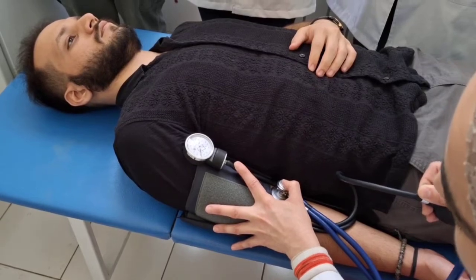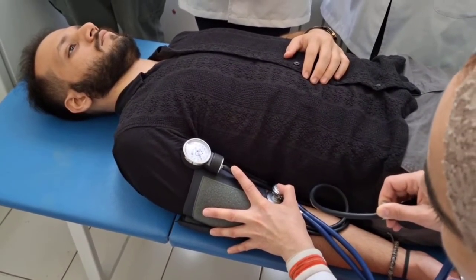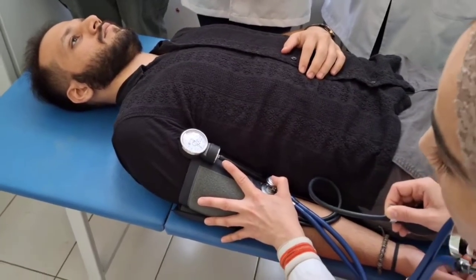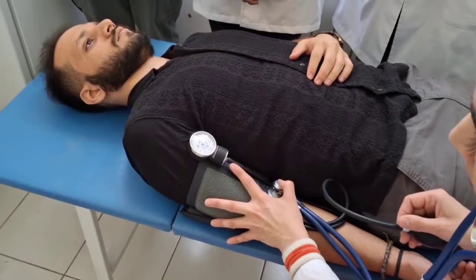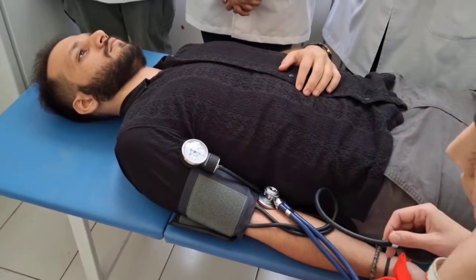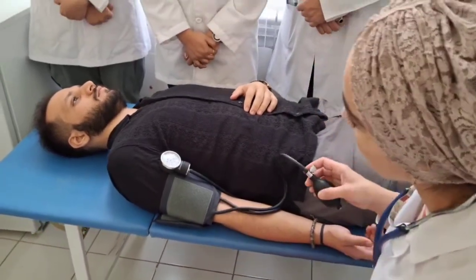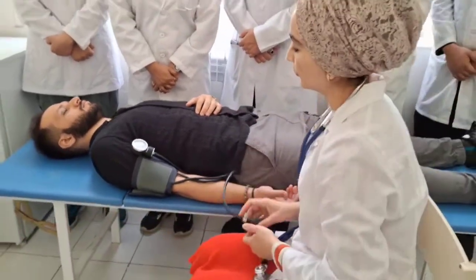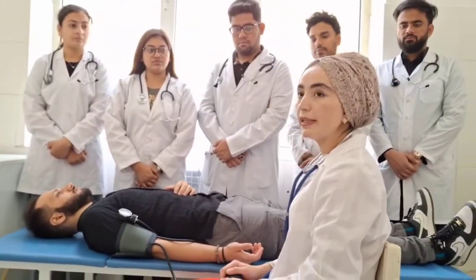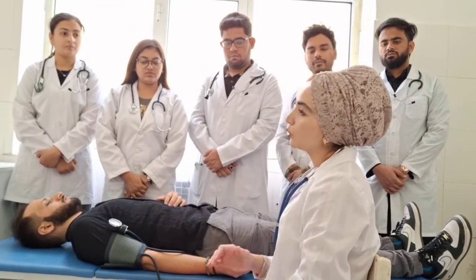The sound disappeared at 60, so his blood pressure is 110 over 60. The difference between systolic and diastolic is pulse pressure — here it equals 50. If it is more than 50–60 millimeters, it can be a sign of heart disease; for example, in aortic insufficiency it can be more than 60–80 millimeters.